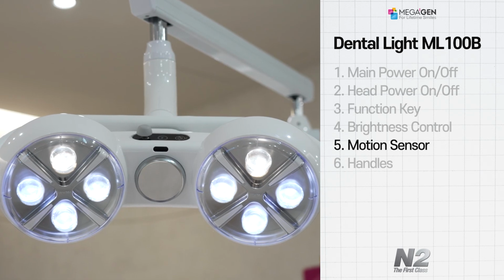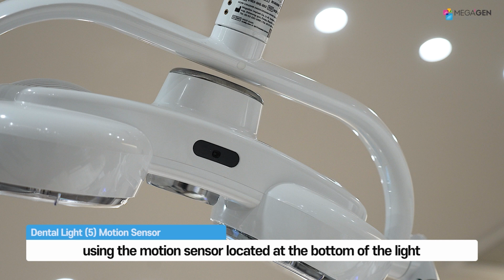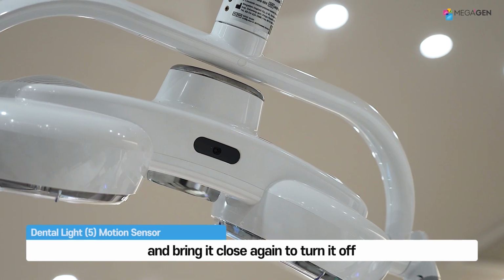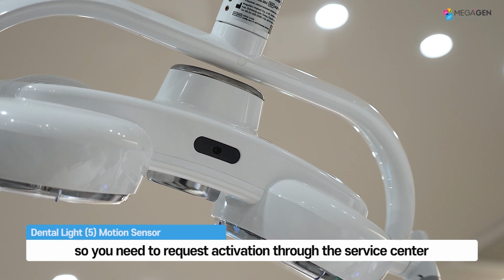How to use the touchless motion sensor for power on-off. The light can also be turned on or off using the motion sensor located at the bottom of the light. Bring your hand close to the sensor to turn the light on, and bring it close again to turn it off. The motion sensor is generally delivered disabled, so you need to request activation through the service center.